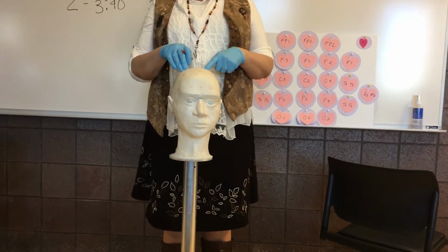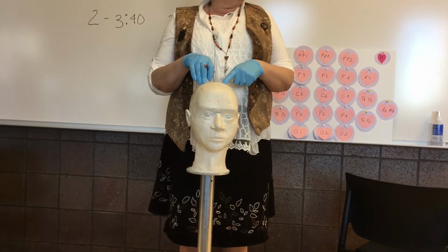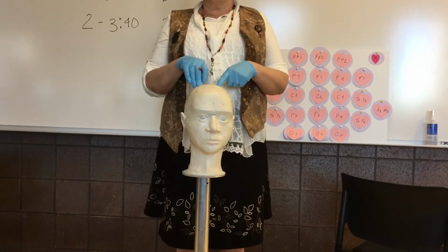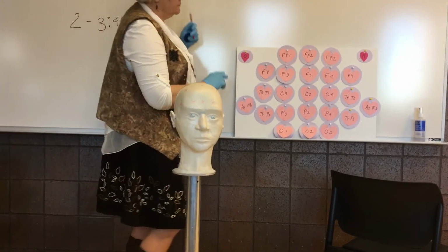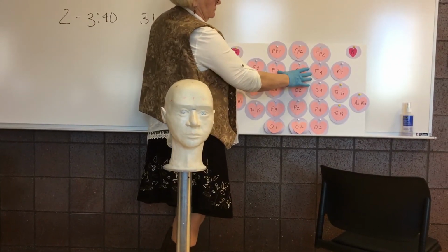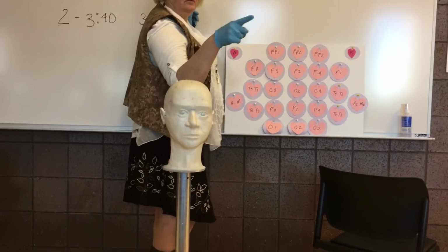That's one of the things you should document on every patient. If they have any skull defects or deformities with electrode deviations or measurement deviations. I think Courtney was first. So if you're moving, like let's say you're moving F4 and then you move F3 just a little bit as well, do you now readjust every, like, off? Nope, you just move just those two. Okay. Who was the next question?